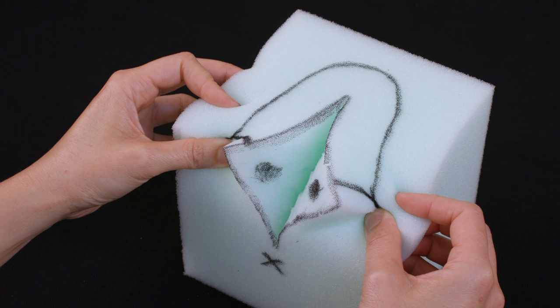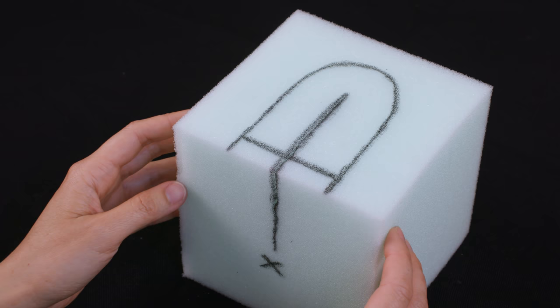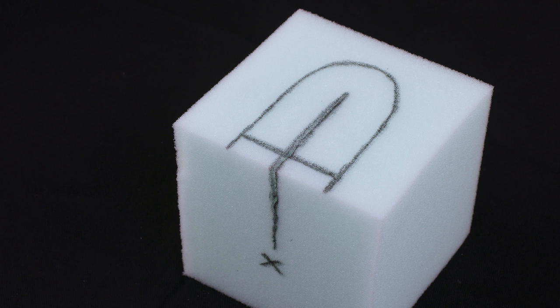As I demonstrate the repair today, I'll be rotating the block for demonstration purposes. But during your time in the workshop while you're practicing, try not to tilt or move the block, which can make suturing easier for yourself. Instead, you should practice moving your wrist, arm, and body position to get a better suturing angle.